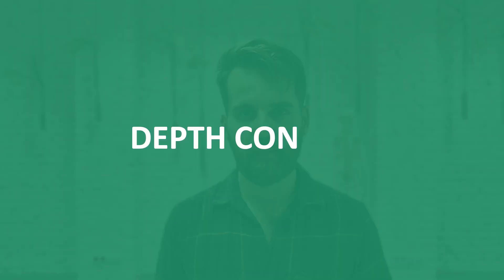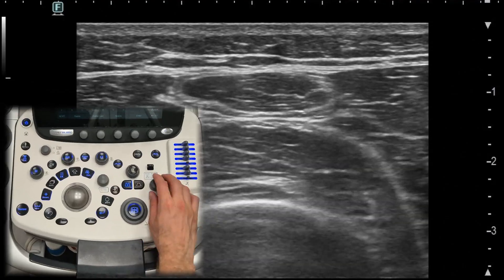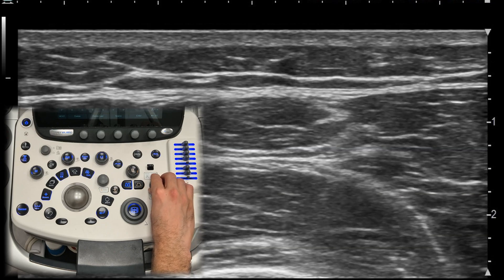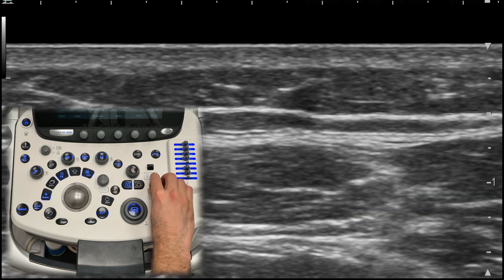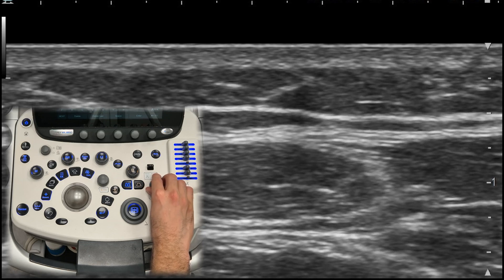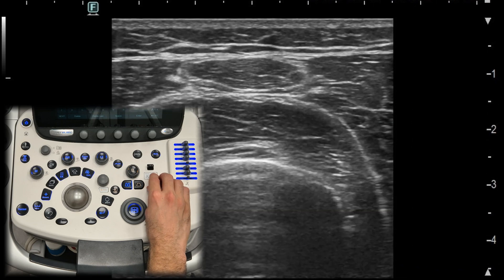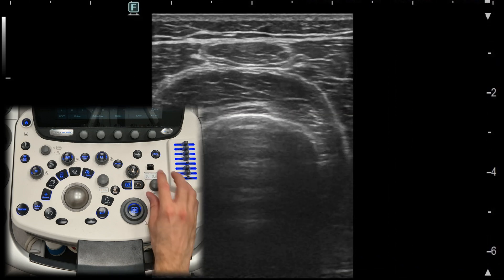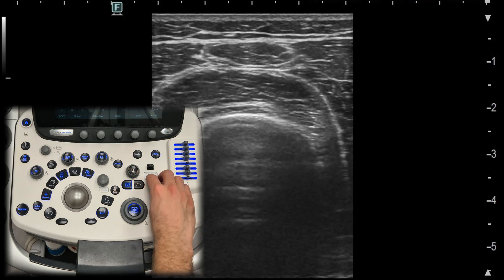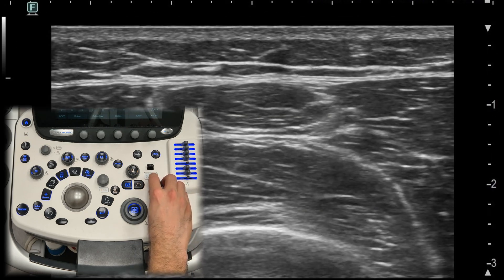Depth control. Depth control is one of the most important controls when it comes to MSK ultrasound. It helps you find the structures you are interested in, whether they are superficial or deeper in the tissue. Start by setting your depth based on the area you are scanning and adjust as needed. You can increase or decrease the depth depending on whether you want to scan superficial or deep structures.